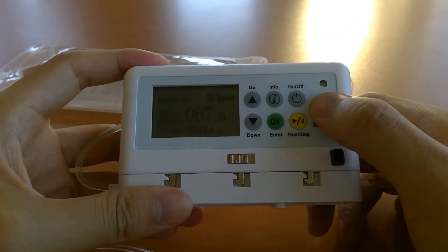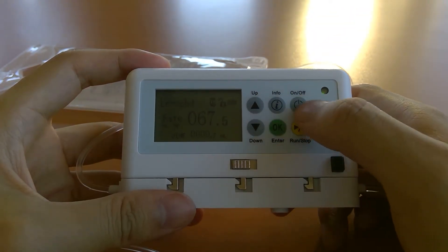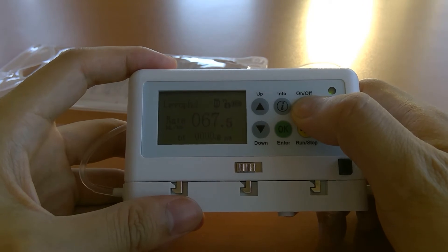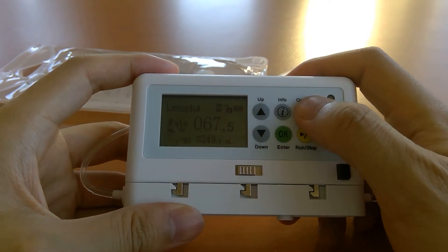The bolus button isn't used — it's there from a previous application. If you want to turn off the pump, you cannot turn it off while the infusion is running, as a safety feature to prevent accidental shutoff. You'd have to pause the infusion first by holding the run/stop key for three seconds until you hear a beep, then hold the on/off button until the screen goes blank.